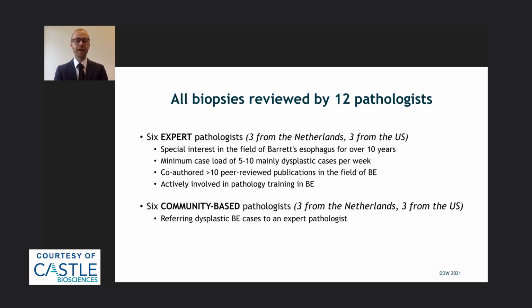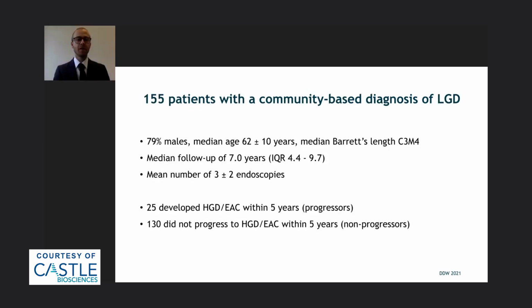All of them are actively involved in pathology training in the field of Barrett's. On the other hand, we had 6 community-based pathologists, again 3 from the Netherlands and 3 from the US. These 6 community-based pathologists usually refer dysplastic cases to an expert pathologist.